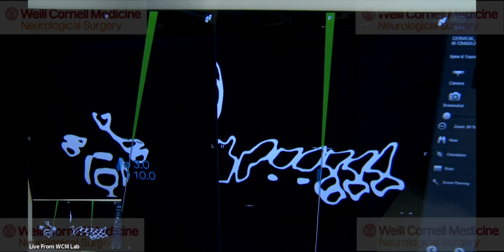Let me just see here. Better? Let's go back to the microscope. Yeah, we're on. Is that sharp and in focus?